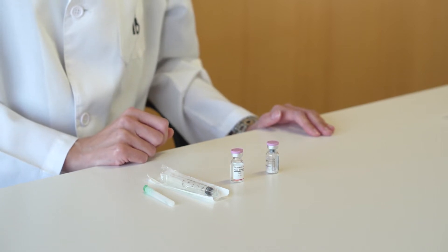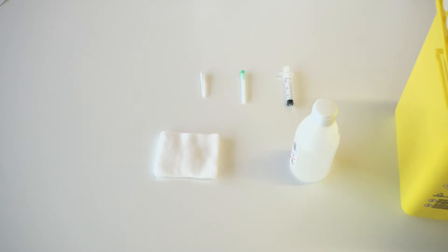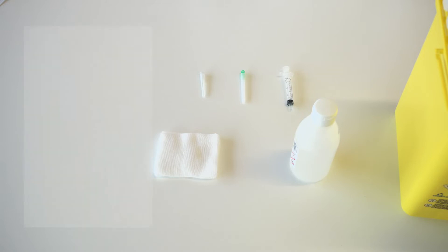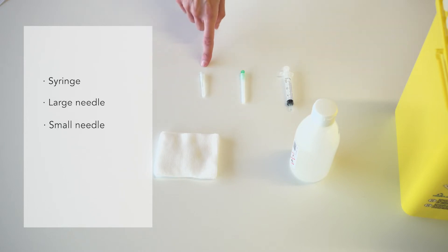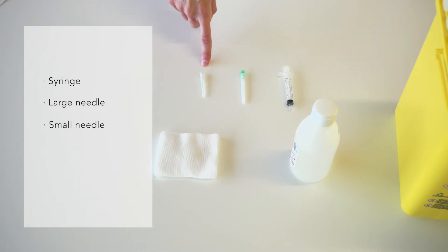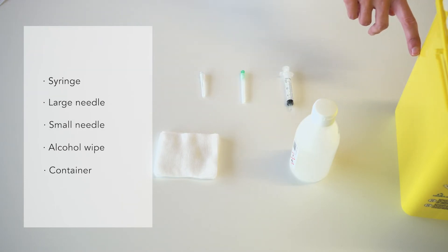Just before administration, the lyophilized vials which contain the active ingredients should be reconstituted with a solvent. The following material will be needed: a syringe, a large needle which will be used to load the medication into the syringe, a small needle for subcutaneous injection, an alcohol wipe or cotton wool, a container for safe disposal of needles and vials. If these containers are not available, they can be delivered to our laboratory for proper disposal.